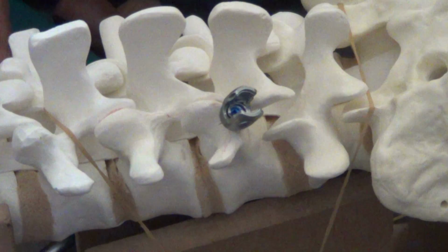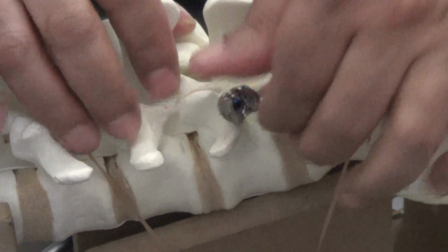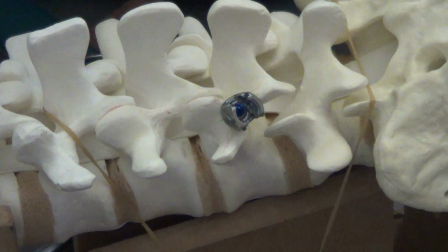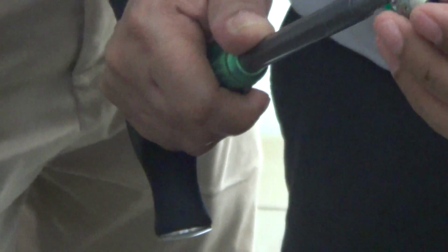These polyaxial screws have 30 degrees angulation on either side. No, you're not pushing it in because it's polyaxial. You can't drive it in. For driving it in, you have to lock this. The mechanism is movement here. So what you are doing is moving it like this. It won't go in unless and until you lock that mechanism. Then see, now you won't be able to move it. Then it will go straight inside. So what happens is this goes inside and locks that up inside.